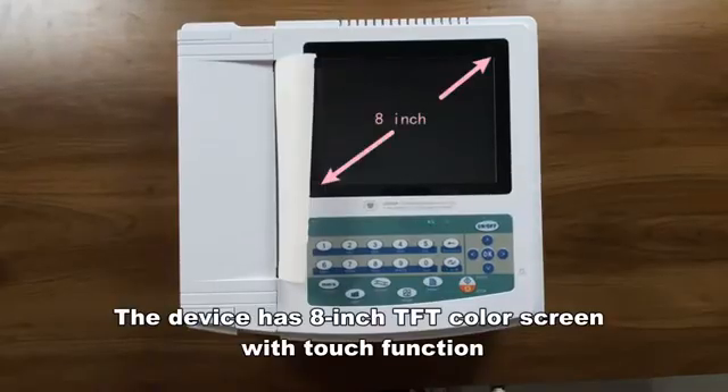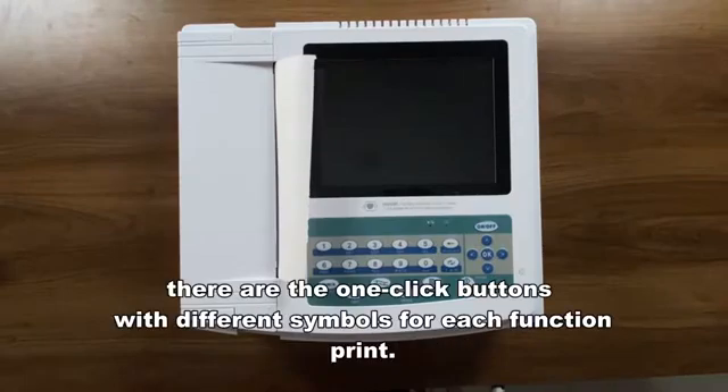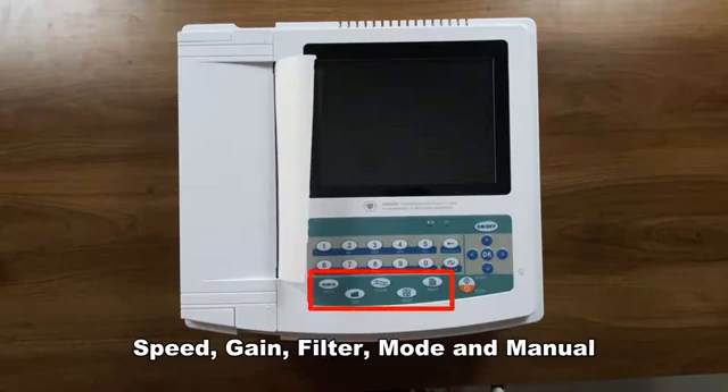The device has an 8-inch TFT color screen with touch function and a keyboard. There are one-click buttons with different symbols for each function: speed, gain, filter, mode, and manual print.